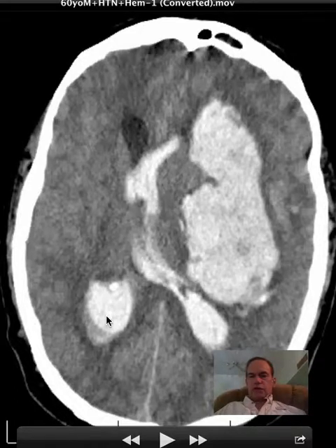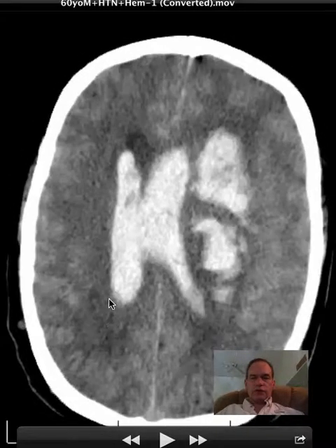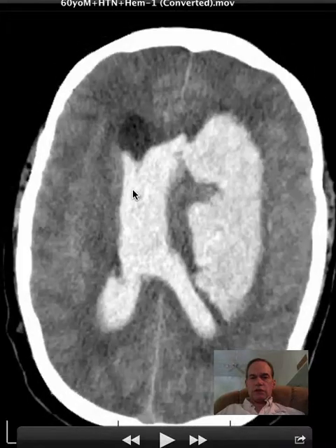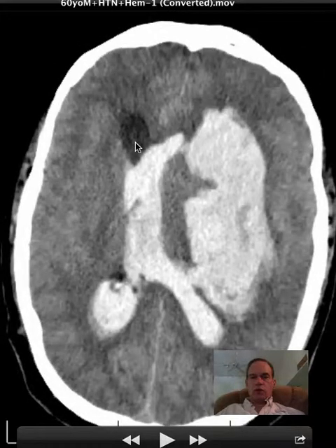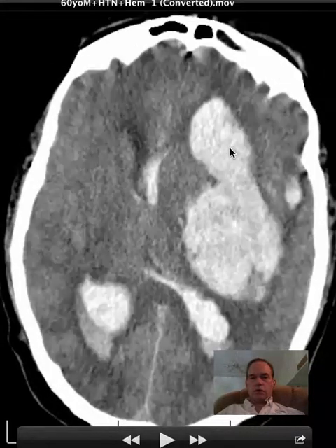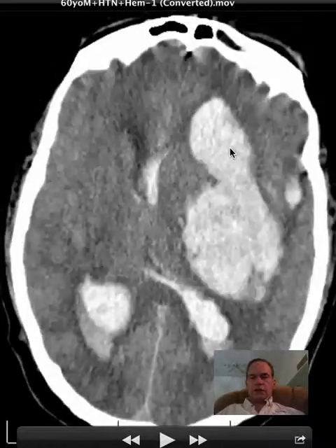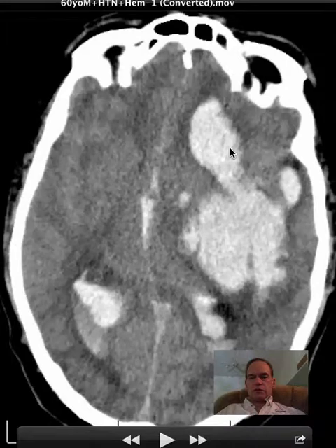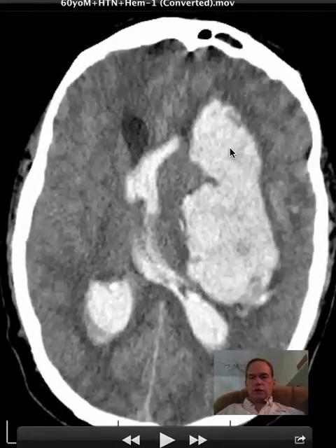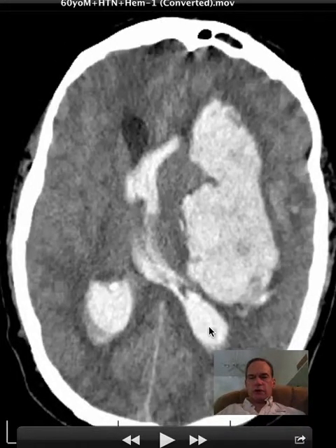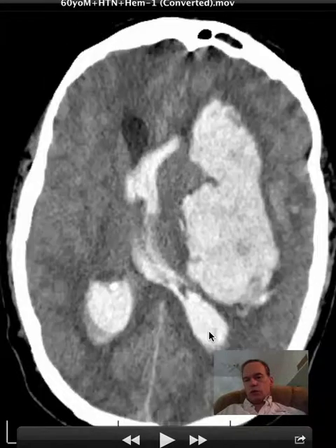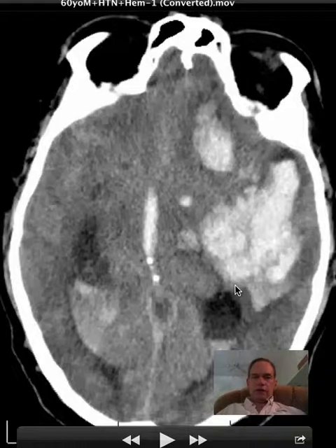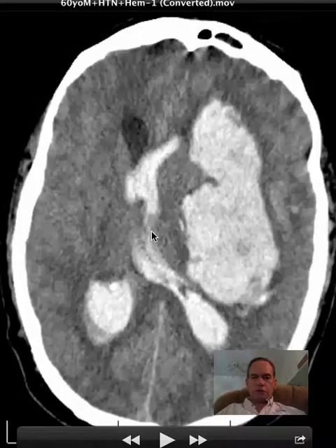You have some blood in the occipital horn of the right lateral ventricle and in the body of the right lateral ventricle, relatively sparing the frontal horn of the right lateral ventricle. Whereas the left lateral ventricle is pretty much filled anteriorly, with just some relative sparing in the trigone or posterior portion of the left lateral ventricle. This is blood in the third ventricle.